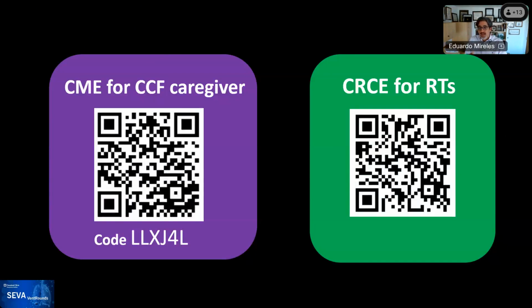If this patient had an outcome that we needed to deal with, I would have wanted that patient to have a higher respiratory rate, a higher effort. So I agree with what Ariel is saying: reduce the respiratory rate and see if the patient is perhaps over assisted, and give them more of the rhythm so that they can trigger the ventilator appropriately, right? I think that's spot on. But if we could not achieve it, perhaps NAVA is an alternative for triggering better, and it will also prevent some of the over assistance issues.